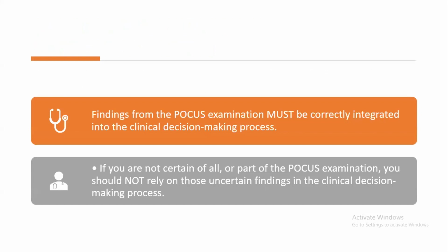First of all, findings from the POCUS examination must be correctly integrated into the clinical decision-making process. So it is part of your clinical decision-making process. It is not a sole investigation. It is a part of your whole examination of the patient. And if you are not certain of all or part of the POCUS examination, you should not rely on those uncertain findings in the clinical decision-making process.